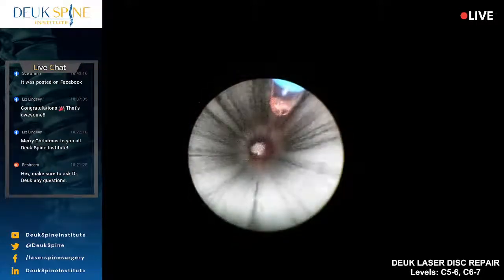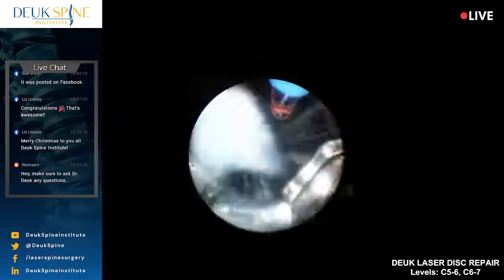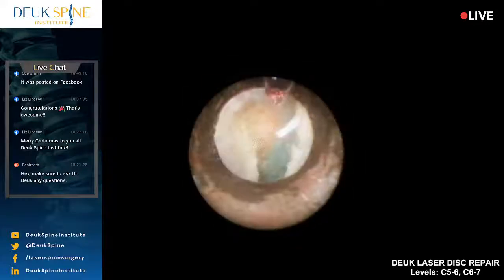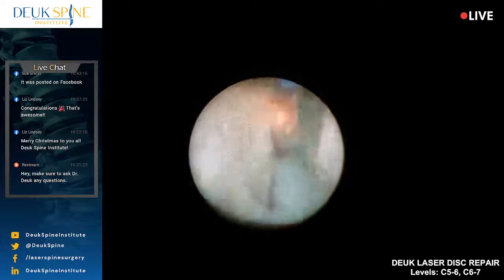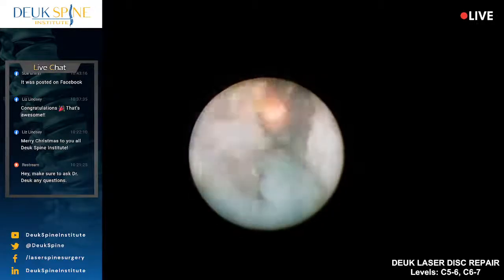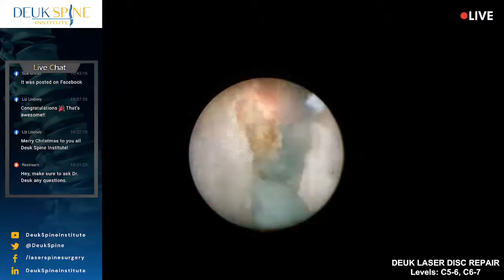Beautiful. Look how scarred up it is. It's so white and dense. That's from scarring. These tissues are normally not white and dense. They're normally very fluffy and soft. See that golden color? That's dystrophic calcification. That's the beginning of bone spurs. That's kind of an osteophyte right there.